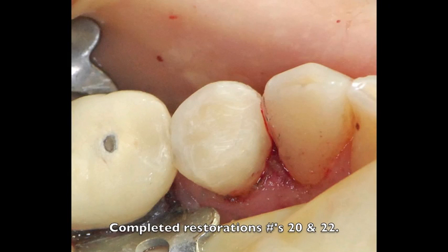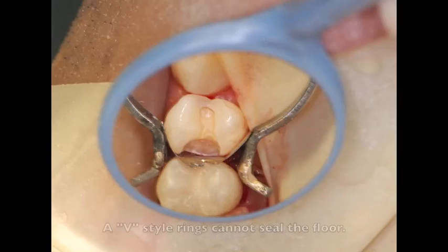The final restoration is very aesthetic and functional for the patient. There are some additional challenges when trying to use a separating ring system. When you look down into this preparation, you notice that the gingival floor is not sealed. The newer V-ring style separating rings straddle a conventional wedge, thereby preventing the wedge from adapting to the gingival floor or being pressed against the gingival line angle, sealing off that part of the cavity preparation.